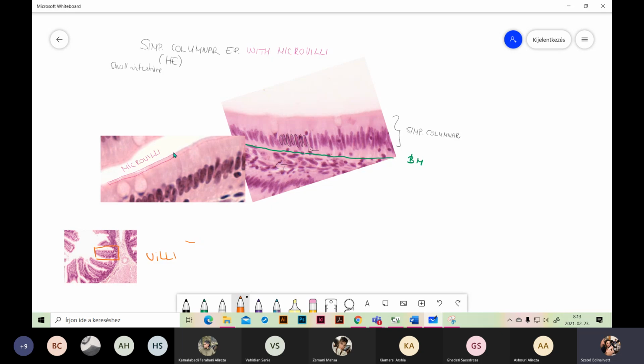The intestine has several types of surface enlarging structures. Microvilli is the modification of the cell, and villi can also be seen macroscopically. You can see them on the surface. What else do you see in this preparation?